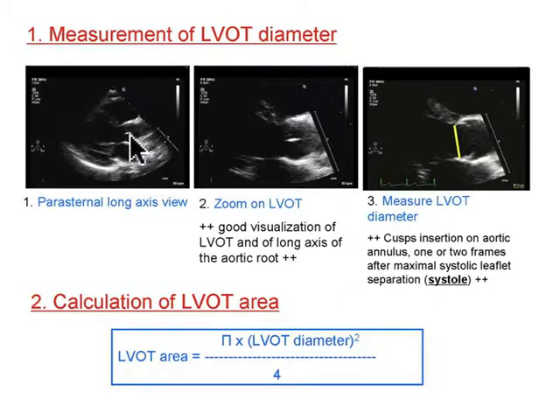And actually right now I could tell that this aortic valve, when they come together, they have that little white line at the tip of my arrow. You can see that little white line. That's the leaflets that came together. And so that's during diastole, the heart's filling, those leaflets are together.